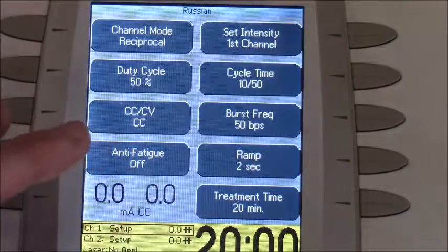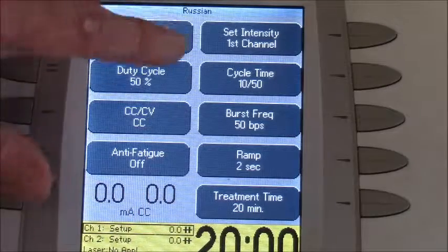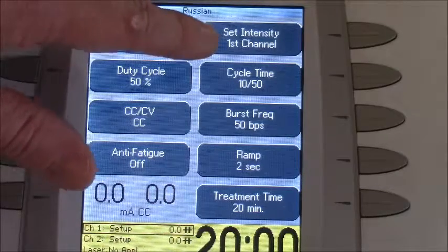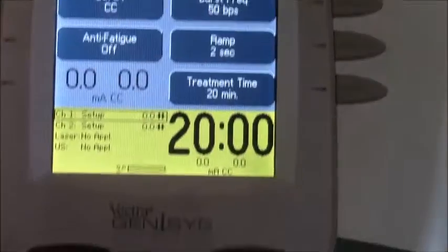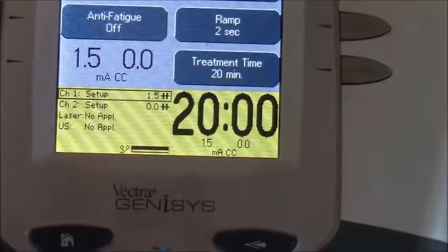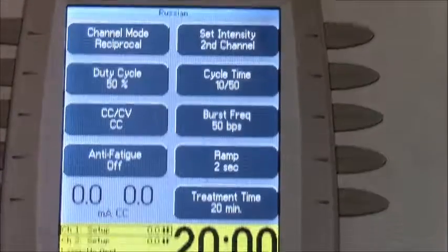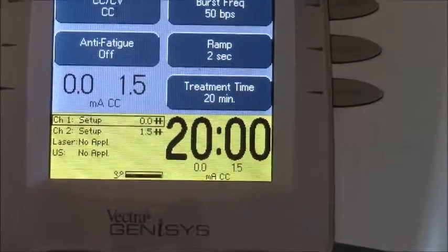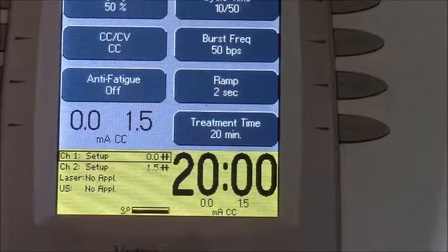If you don't need to change any other parameters, you don't have to, but know that you do have the availability to do so. It defaults to setting up the first channel, so assuming you have your leads set up to your desired application, increase the intensity with the dial to your desired level. Then go back up, click on 'Set Intensity,' and that gives you channel two — increase your intensity to the desired level and you're ready to go.